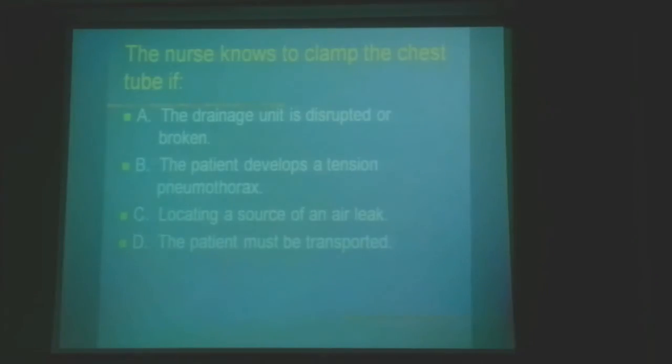Excuse me, I have one question. Go ahead. With a chest tube, should we position the patient to that side or not? Because if we position, the tube will be compressed. You're asking about positioning of the patient? You can position the patient at 45 degrees, but make sure the patient is not lying on his chest tube. You cannot reposition him onto his chest tube. So we should avoid that position. The most important thing in a chest tube patient is the chest tube.